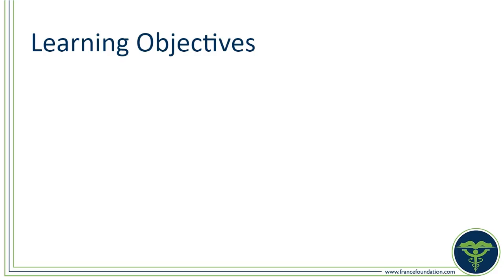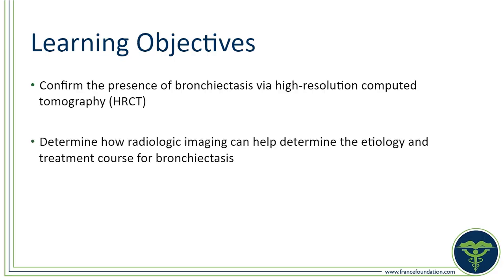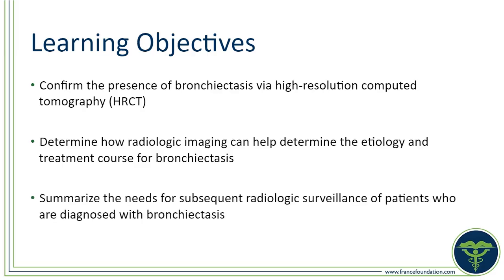Our learning objectives today will be to confirm the presence of bronchiectasis via high-resolution CT, determine how radiologic imaging can help determine the etiology and treatment course for bronchiectasis, and to summarize the needs of subsequent radiologic surveillance of patients who are diagnosed with bronchiectasis.